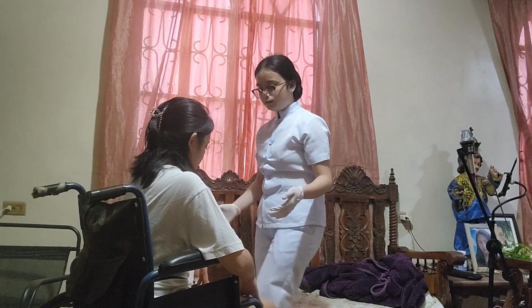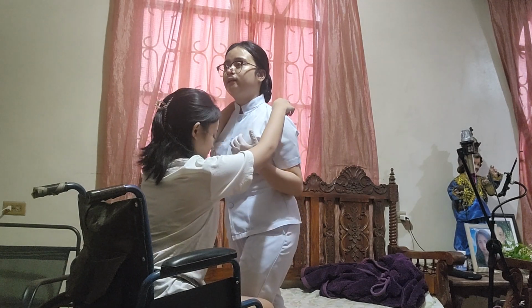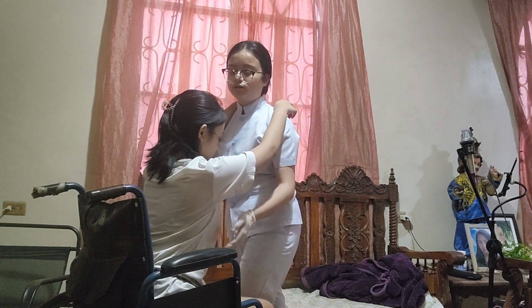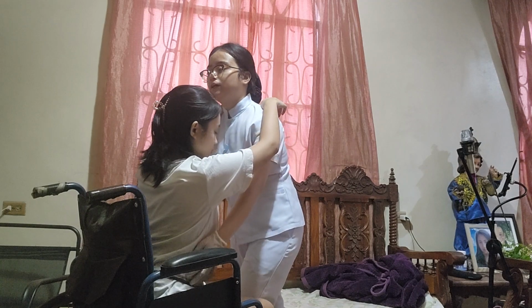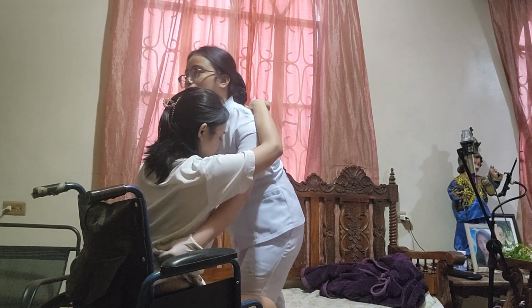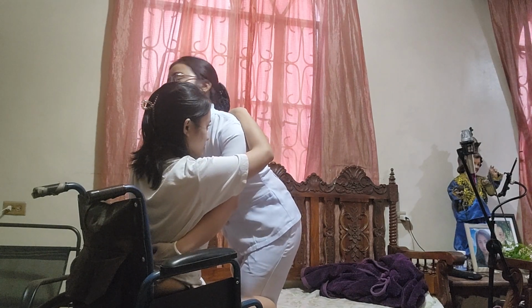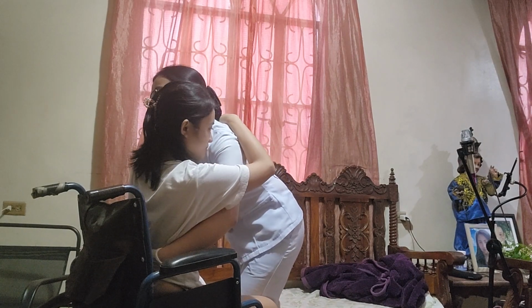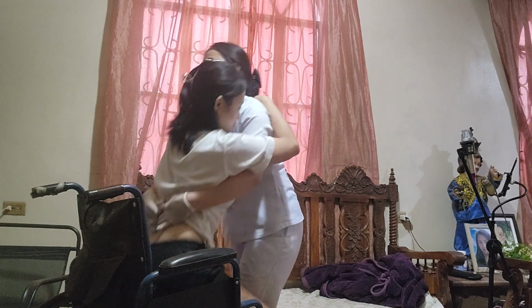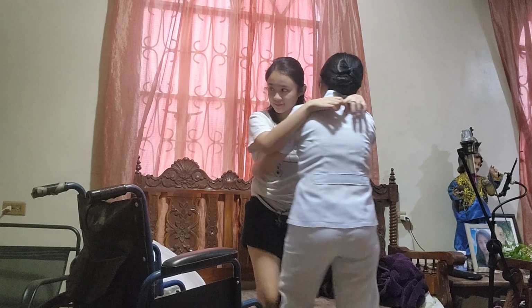And then, you will need to lean near the patient, of course, to prevent the patient from falling and getting injured. On the count of 3, you will assist the patient to stand. So 1, 2, 3. And then slowly transfer her to the bed.